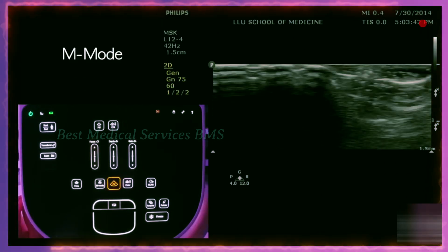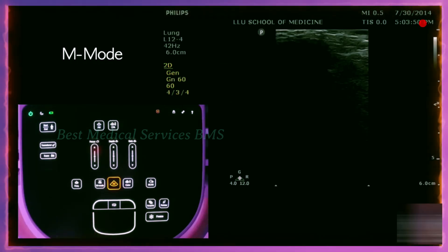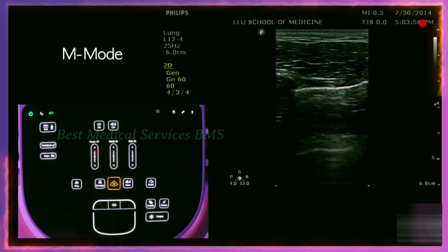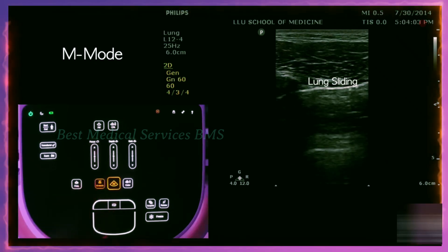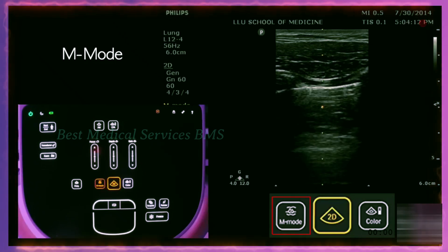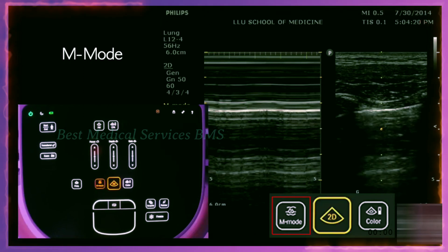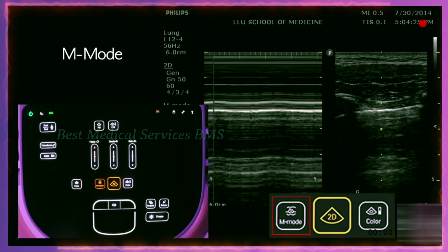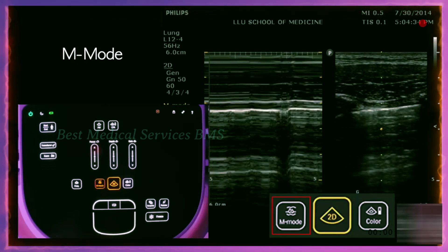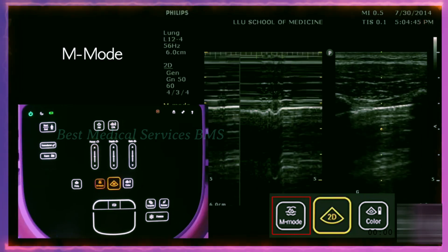The other important mode is M-mode, or motion mode. We're going to look at a lung setting — specifically the lung sliding of the visceral and pleural layers sliding across each other. If I put the M-mode cursor on, you see yellow dots going straight down. The ultrasound probe will only measure motion along that one line. Push the M-mode button to activate it, and everything else disappears — it's just scanning that one line over time. This is normal lung sliding: it has a sandy appearance when breathing in and out, and that motion of the pleura is captured with M-mode.